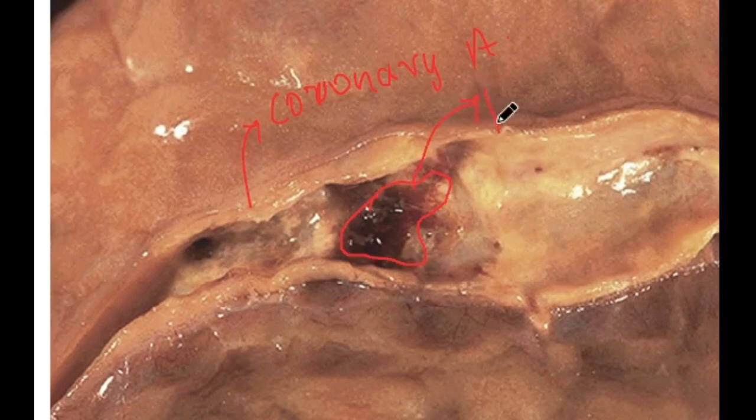This is the atheromatous plaque, which is occluding the artery and has resulted in narrowing of the lumen also. This is the hemorrhage which you see in the plaque, a focal hemorrhage, which is a complication of atherosclerosis.